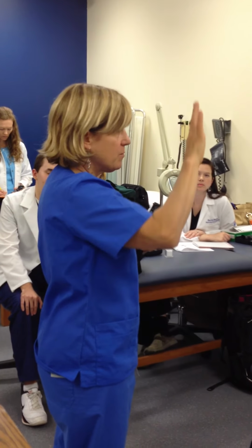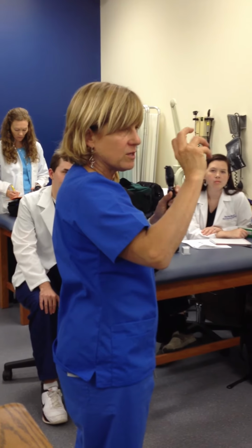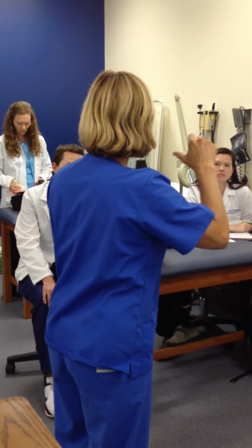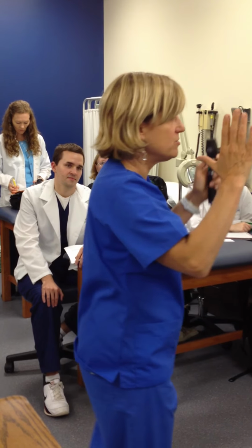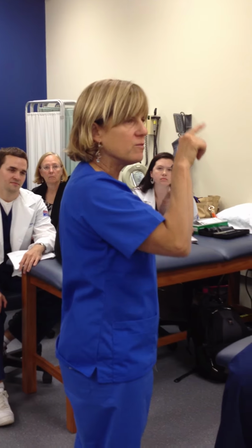So we wanna get up in the outer quadrants, inner quadrant, down low, and then you're looking for the optic disc, you're looking at the vessels, looking for any hemorrhages, exudates, and then right at the very end you say, look directly into my light. When she does that, the macula comes right into the light, and you're looking for the macula.